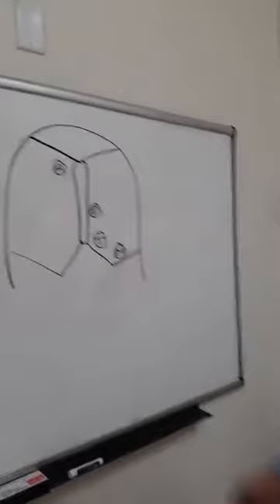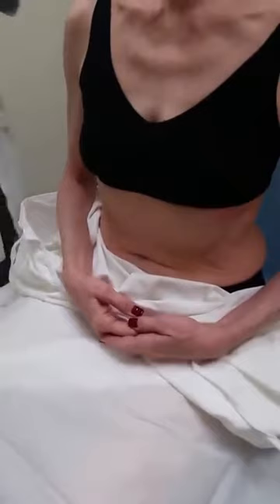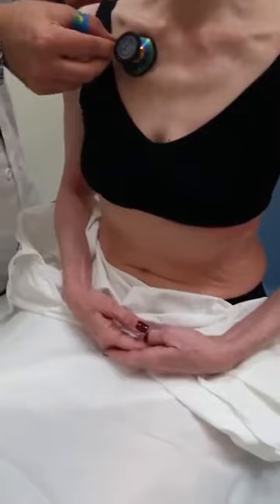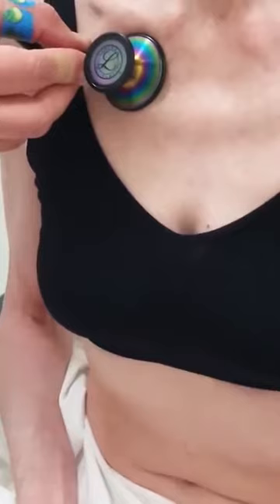We'll now move to doing these assessments on our live patient, starting again with our diaphragm just to the right of the sternum, second intercostal space, and auscultating. This is the aortic listening post.